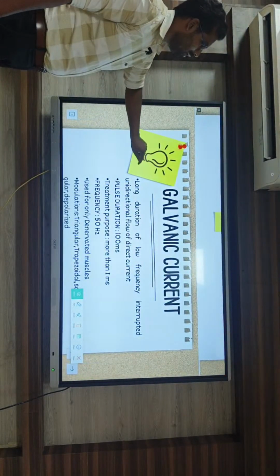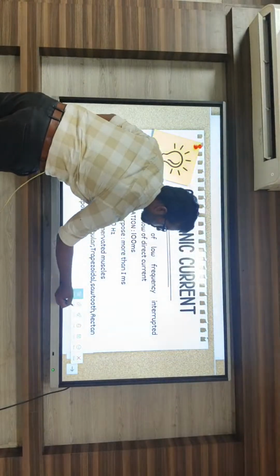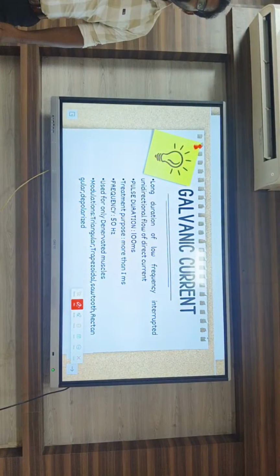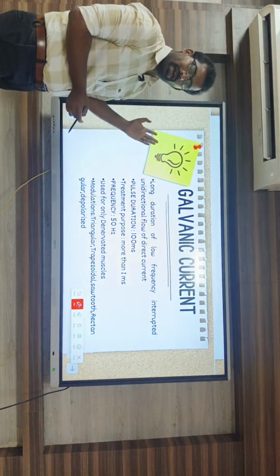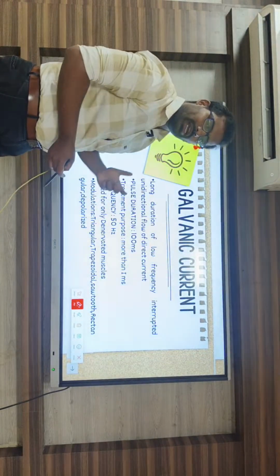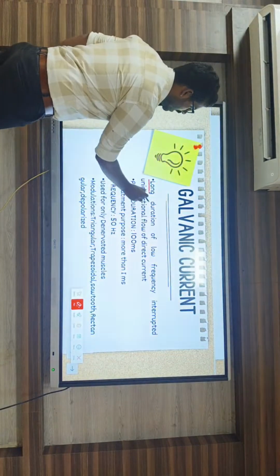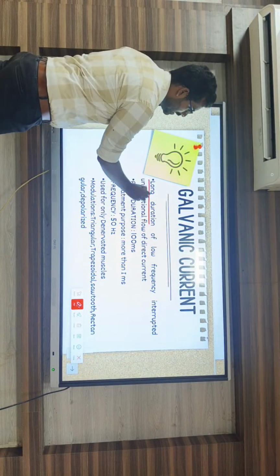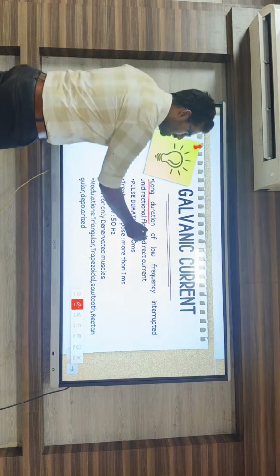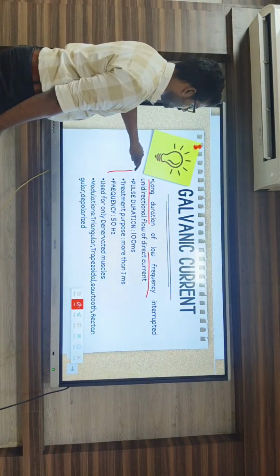First of all, coming to the galvanic current. Galvanic current is just vice versa to the Faraday current. What we discussed in our Faraday current is the short duration interrupted unidirectional flow of the low frequency current. This one is the long duration. So the Faraday current is short duration and the galvanic current is long duration, a low frequency interrupted unidirectional direct flow of the current.